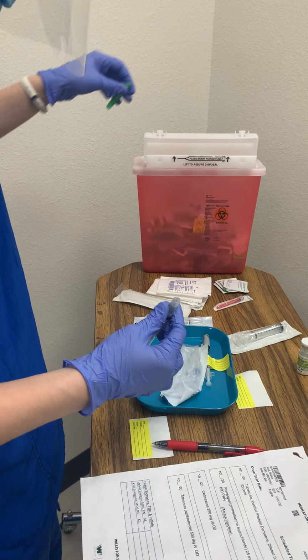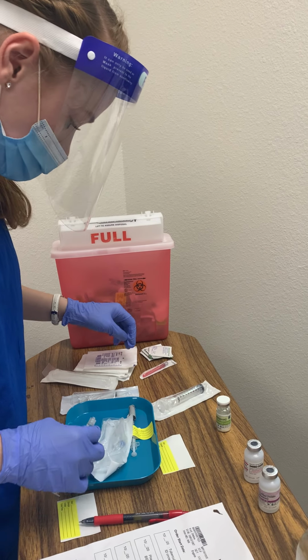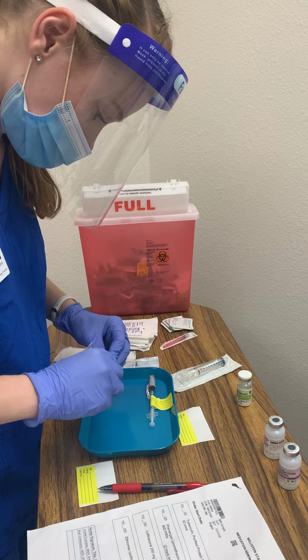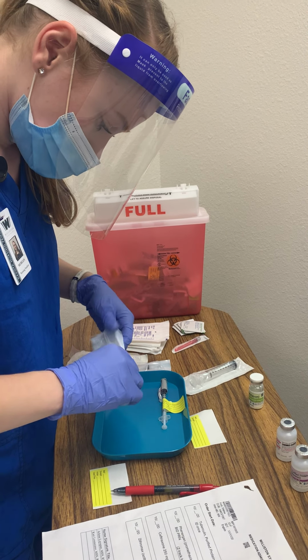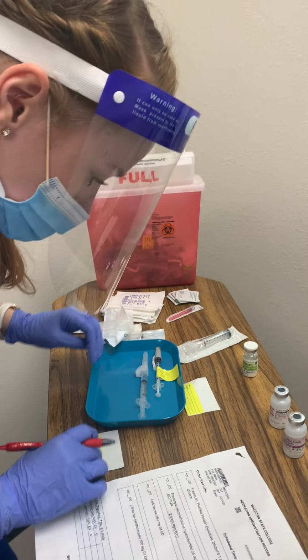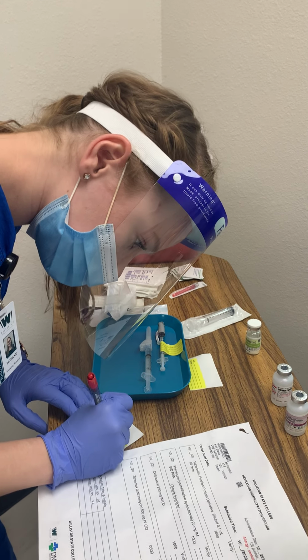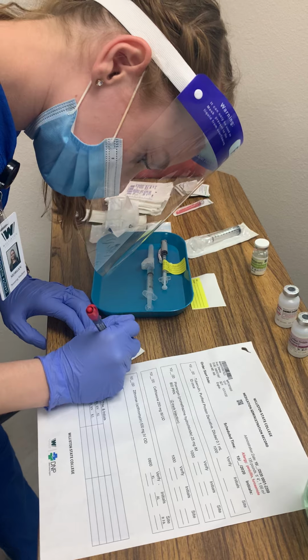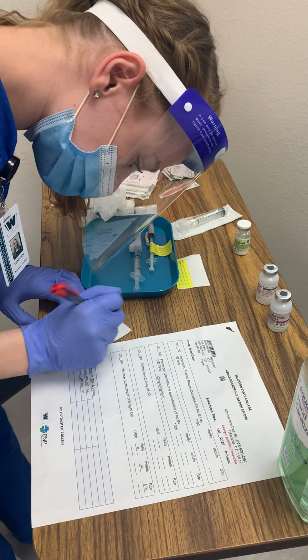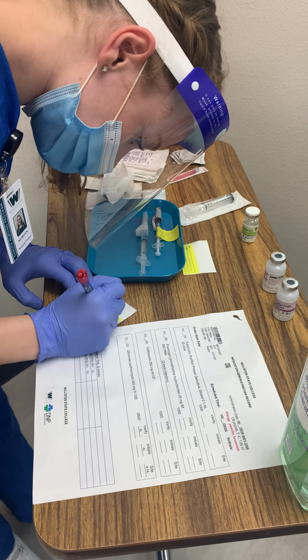And then I'm gonna take it away. And then I'm gonna put the correct needle on it for when I give it. So I'm just gonna screw that on, perfect. And then I'm gonna be doing my second med check. So, Phenergan. And then, perfect. And then 1 ml.